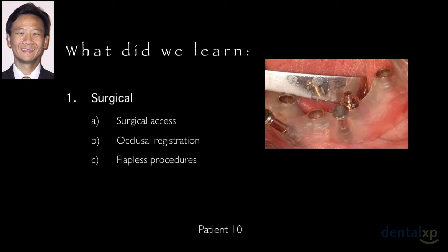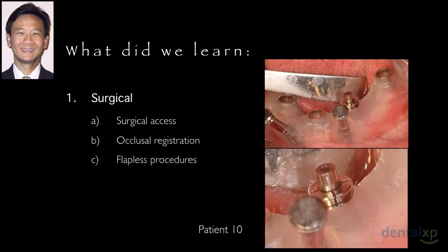Remember that with soft tissue or bone templates, these are now flapless procedures. And with flapless procedures, it has become more crucial about access of visualization, access of each implant that is placed. The position or placement of these implants may be simplified, but the actual procedure has become very crucial and being very specific about trajectory, access, height in the XYZ axis, registration of placing each implant in the precise planned position.